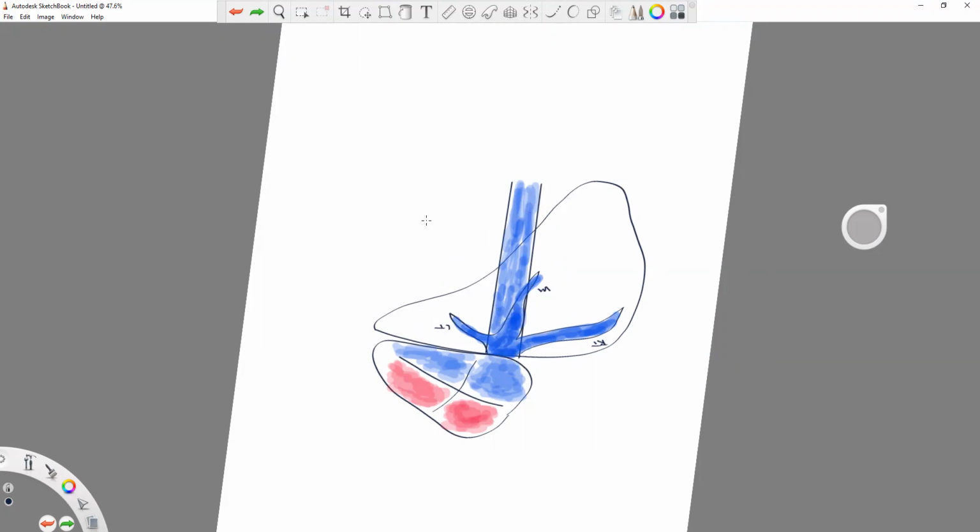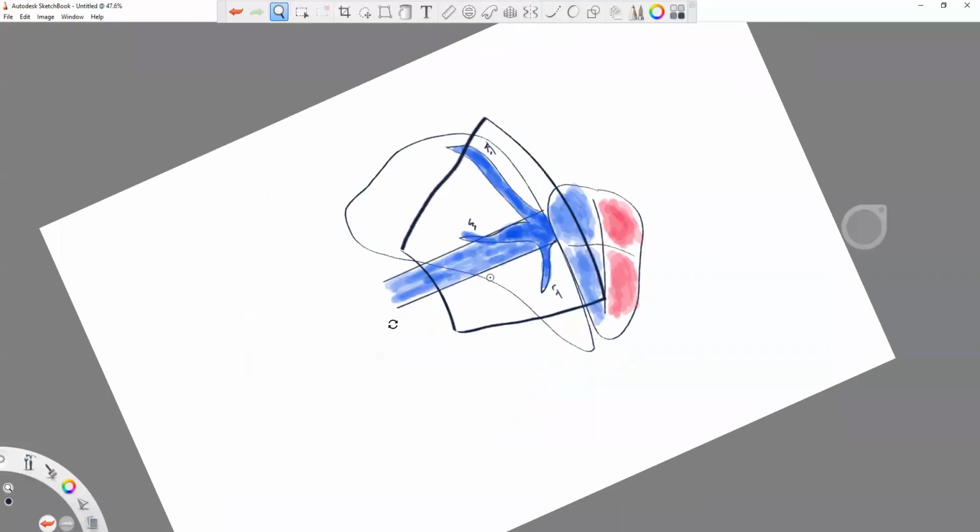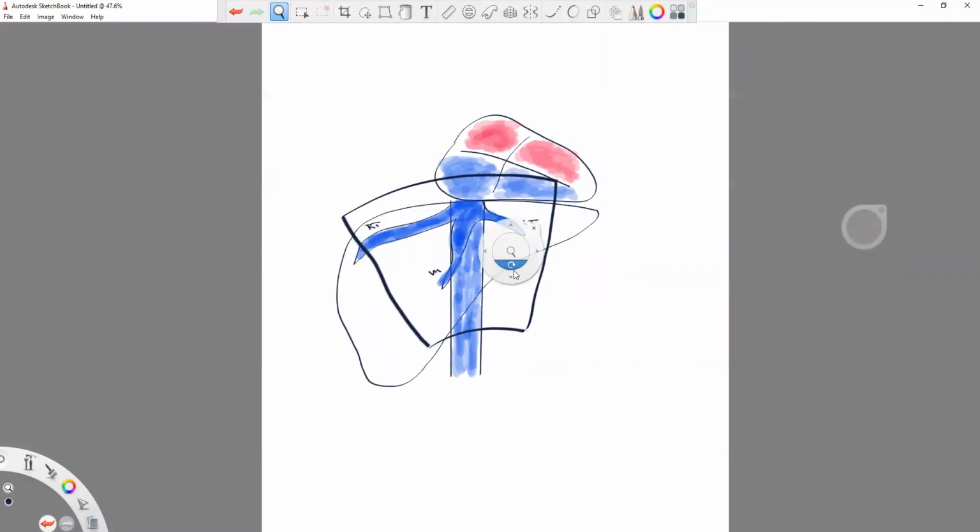All right, actually, pause it real quick. Okay, I wanted to redraw the transducer. So this is not perfectly accurate, although it starts to get us thinking in the right way. All right, here's back to our normal physical position. Transducer is down here. It's a curved transducer. We're holding it in the lower epigastrium, a little bit towards the right shoulder. Have the patient take a deep breath in.